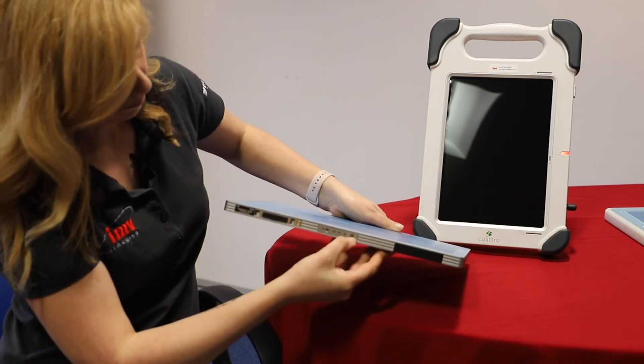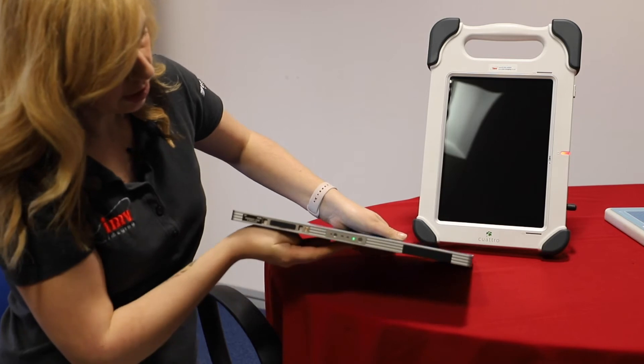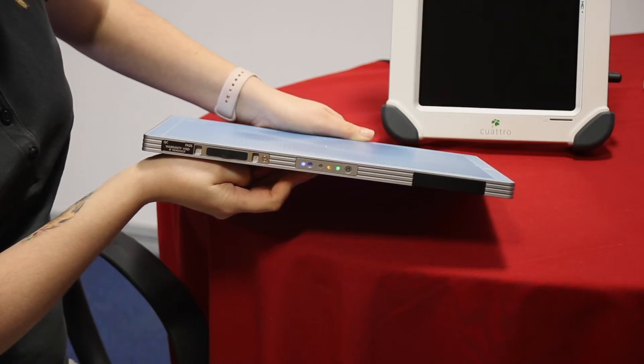The on switch is here. Press and hold for a second until it starts to flash, and then it will light up as a solid green light.